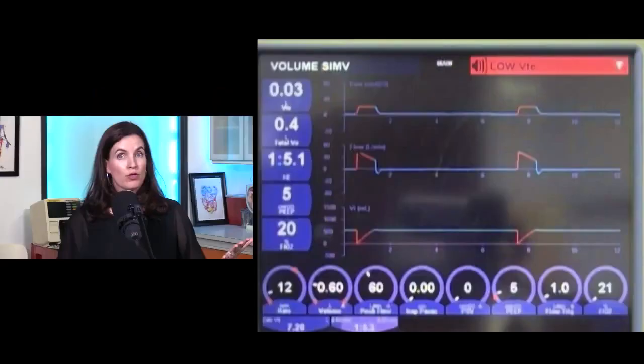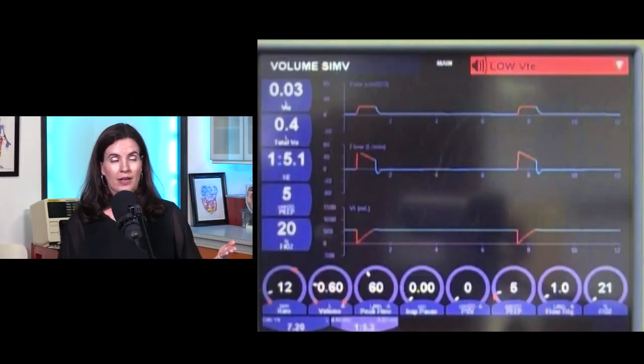All right. So step 3 is you're reading what is red and flashing. This brings us to step 4. Step 4 is the critical moment here, where you still don't know what that alarm means, but you are now standing in the room with your patient, and you are a smart, educated healthcare provider who can probably do some easy stuff at the bedside.